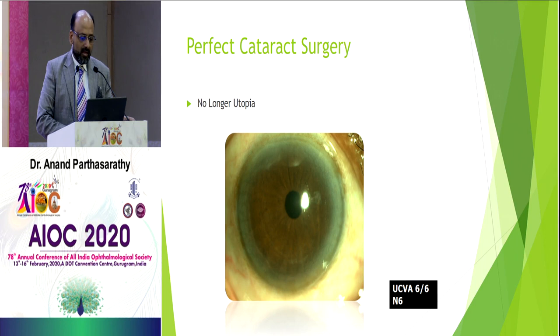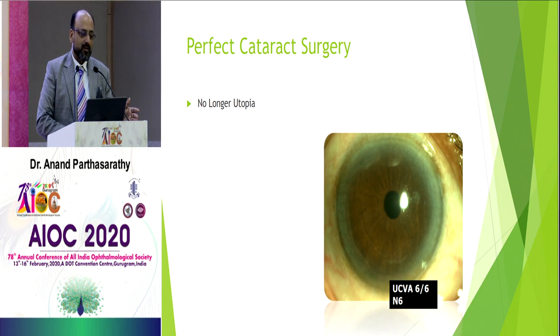Now, in getting perfect results, I think there is no longer any utopia. It's fairly common to get good vision if you've done your planning, like this patient who was in our OPD about a week back with uncorrected 6/6 N6 post-surgery.